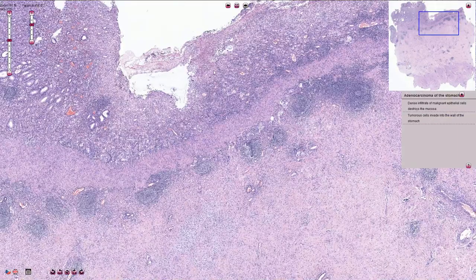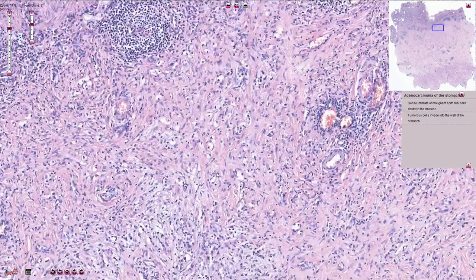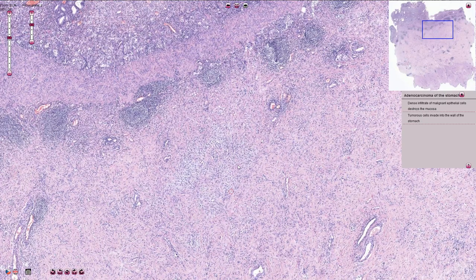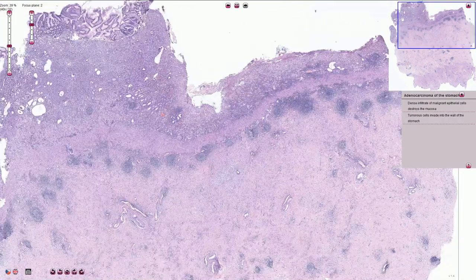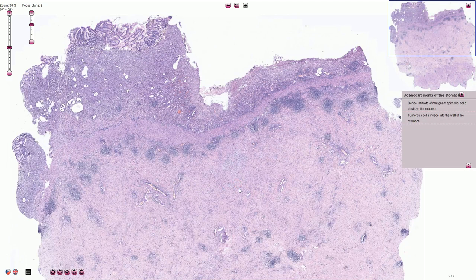Here we have the mucosa infiltrated by the tumor. This is the lamina propria, and here we are in the submucosa. On higher magnification we can see that these malignant cells are also present here — this is infiltration of the submucosa by the poorly cohesive carcinoma. It is quite useful to use immunohistochemistry because these cells can be quite inconspicuous, and sometimes we are surprised to see that it goes much deeper than originally thought.